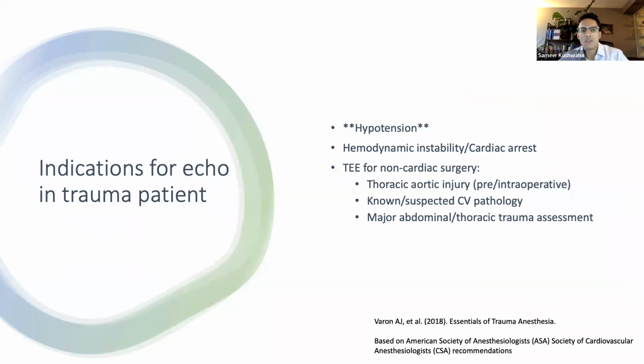There's many reasons why we would do echo in a trauma patient. I think it should always be considered if somebody is hypotensive, especially if they're not responding to initial resuscitative efforts. In patients coming in with cardiac arrest, one of the key factors in them surviving that arrest and surviving to discharge is early identification of the cause of their arrest, especially if it's something that can be reversed.